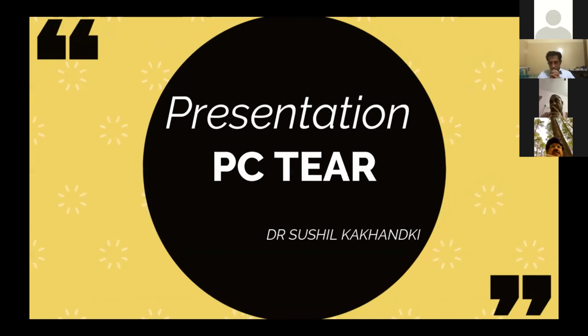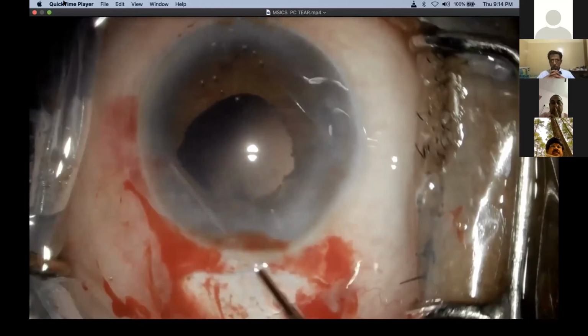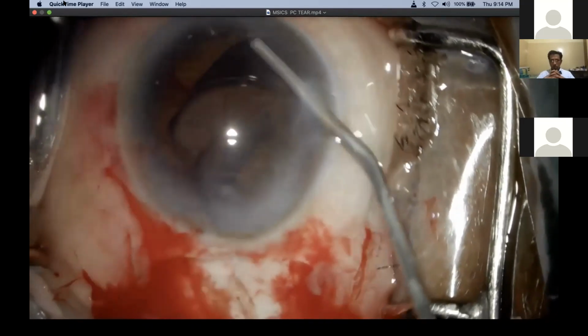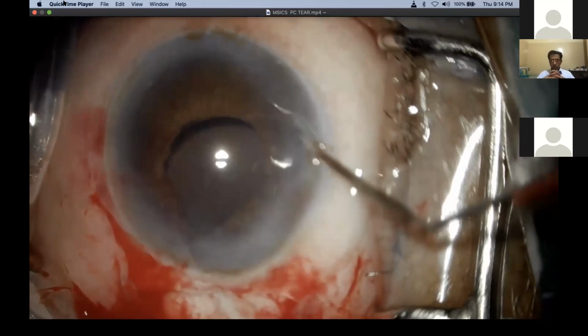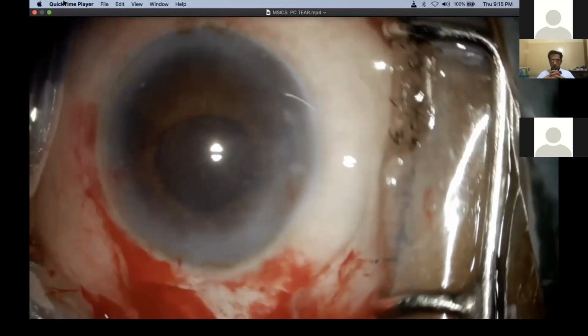But in many of my cases, the posterior capsular tear has occurred during a cortical wash. Is it important for us to recognize the stability of the posterior capsule before you implant the lens? Yes, it is very important to assess the stability. In this case, you can see I was just focusing on the anterior capsular rim, and you can see what happened. So the PC tear was unnoticed. It was because of pupillary constriction, and the PC tear gave way to a lens drop. I don't know in which step the PC tear occurred, but I ended up with a nucleus drop in this case. In such a situation, for solo practitioners, it becomes very difficult to explain to the patient the further management.